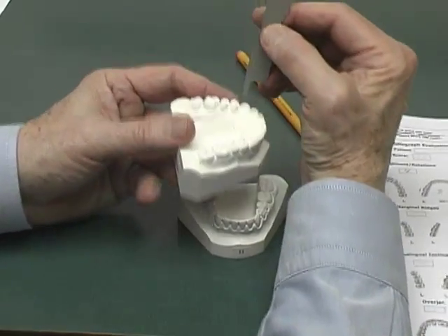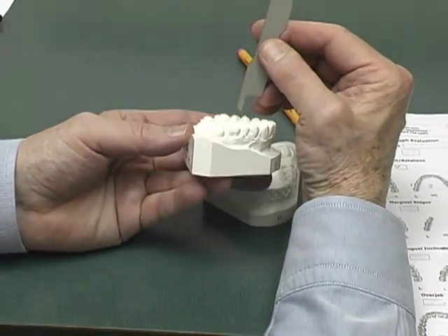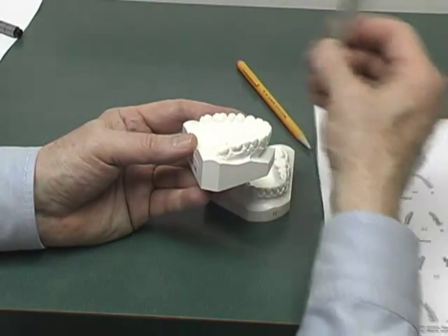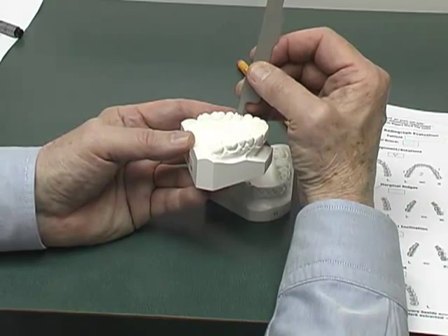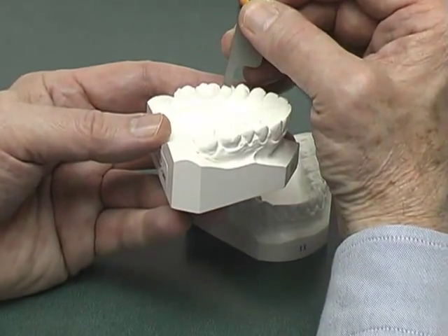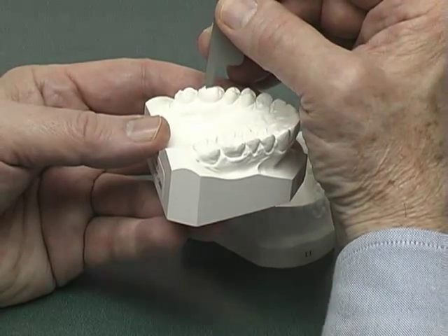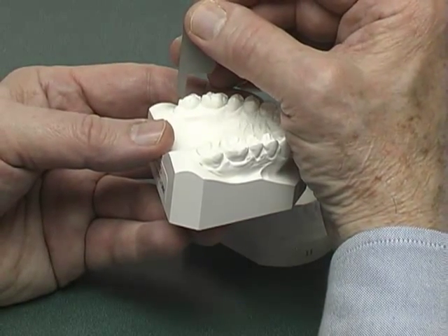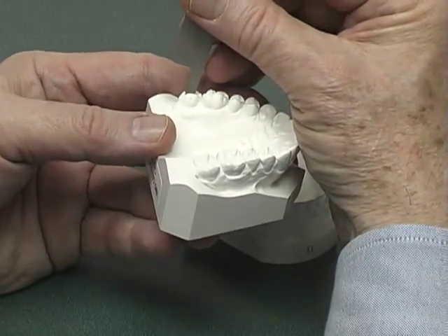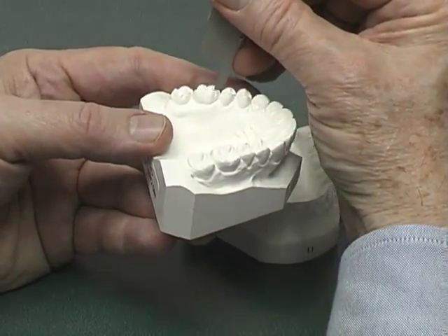Hold the gauge perpendicular to the occlusal plane. Hold it perpendicular. Run the 1 millimeter step along the posterior teeth marginal ridges, moving in the mesial to distal direction, then reversing and moving distal to mesial.